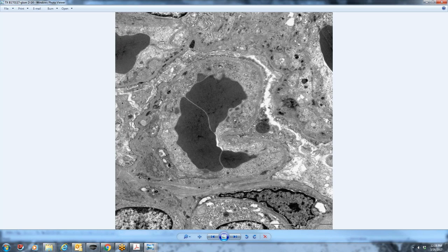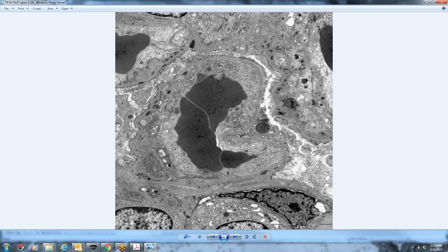So this was an unusual appearance to this particular case. It was still mostly immune complex deposition on the sub-endothelial zone and then the presence of the humps being the atypical lesion. What's weird about a post-infectious GN in humans, which often has humps, is that even though it's supposed to be mostly complement sitting on the abluminal surface, it still is quite a proliferative process.